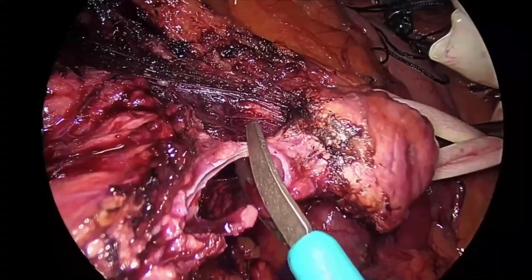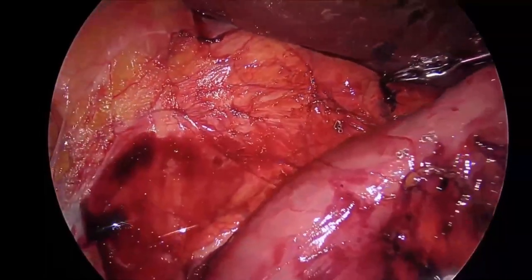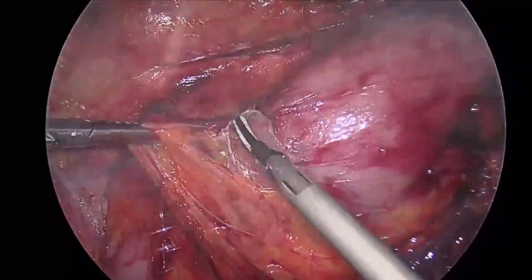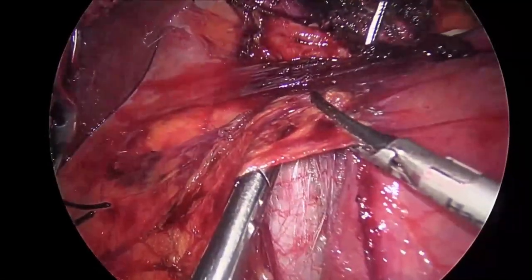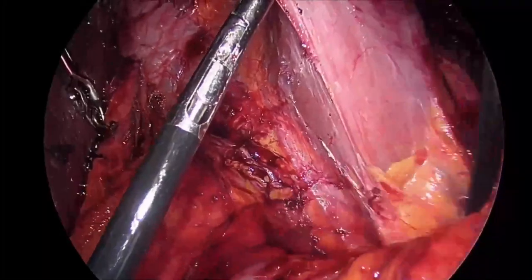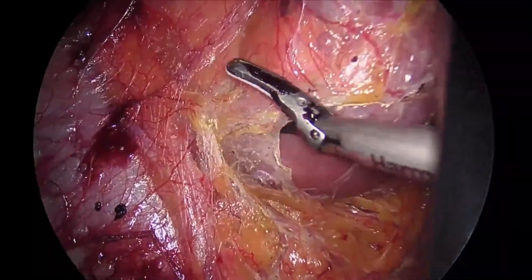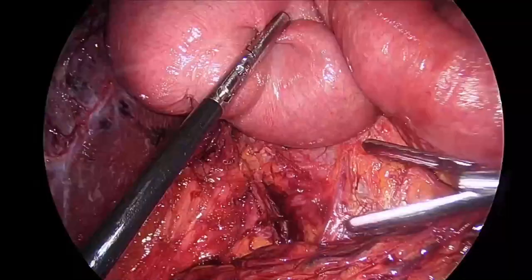Then by using the free limb of the ultrasonic shears, the pancreatic duct will be identified independently. The pancreatic duct is now divided with scissors. A wide Kocher maneuver is performed. The ligament of Treitz will be approached from the right. The dissection is done under direct visualization, and the 4K technology allows us to clearly see the different layers. The ligament of Treitz is opened.